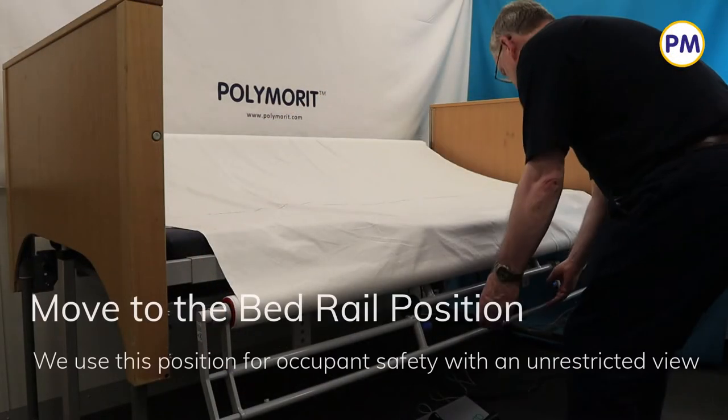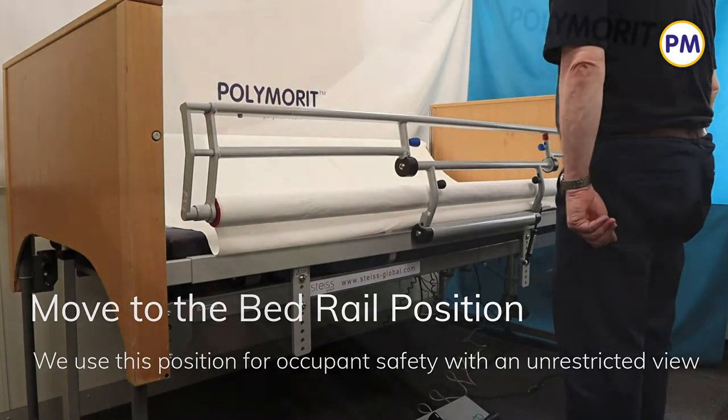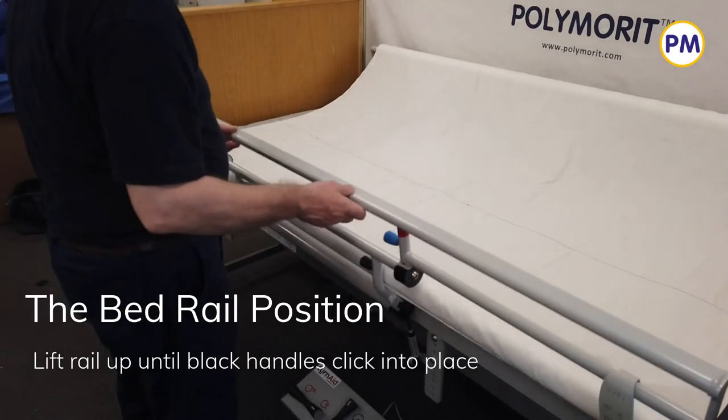We use the bed rail position for occupant safety, but with the roller at the bottom it allows an unrestricted view. Simply lift the rail back into position until the black handles click into place.